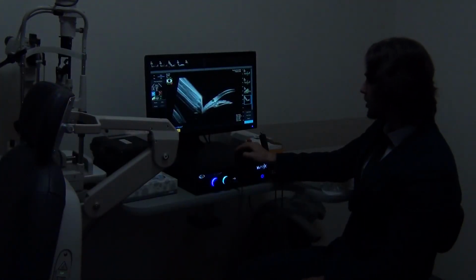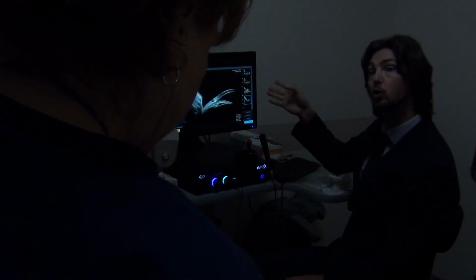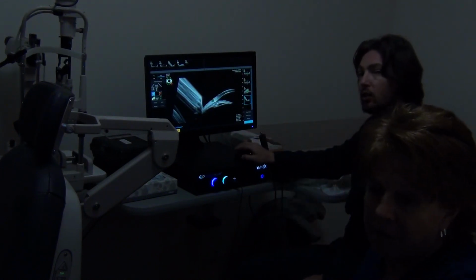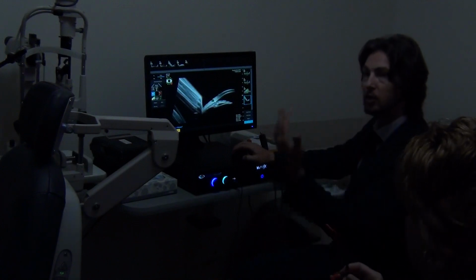So we're gonna finish the exam, right? So again, if you need to, do you usually print images? We will be, yes. You will be printing images, right? Not the reports, or do you like to do both? The reports. The reports is what I've been doing. Let me just complete that step then.